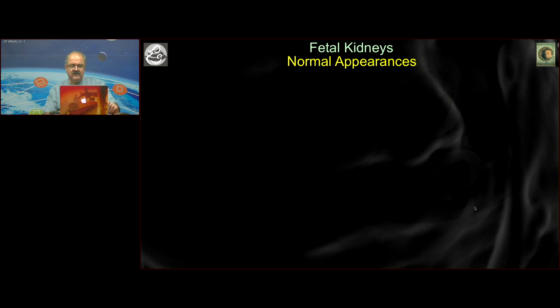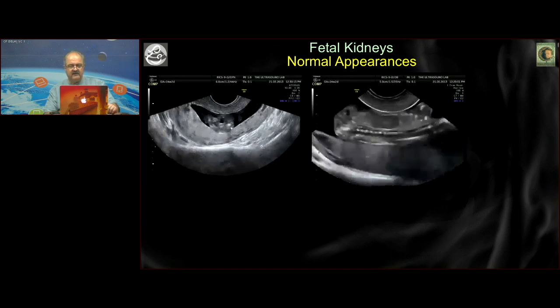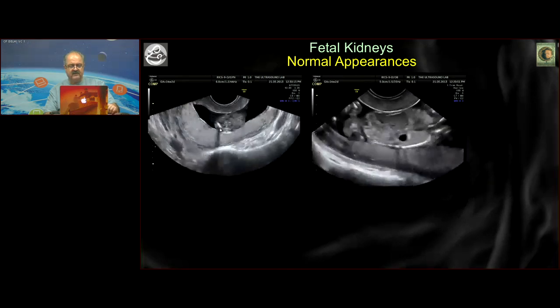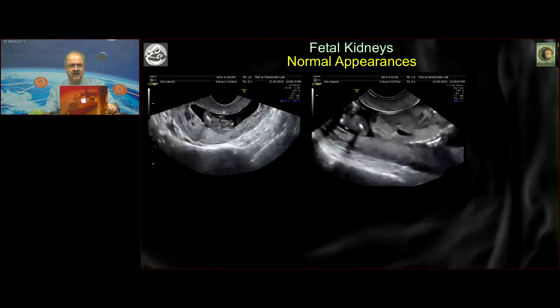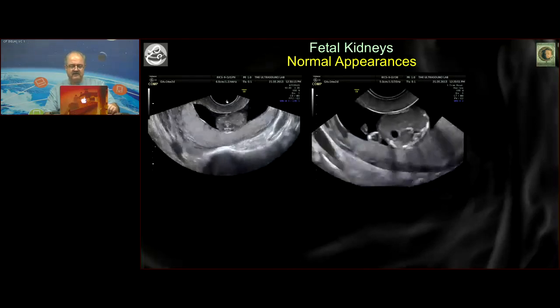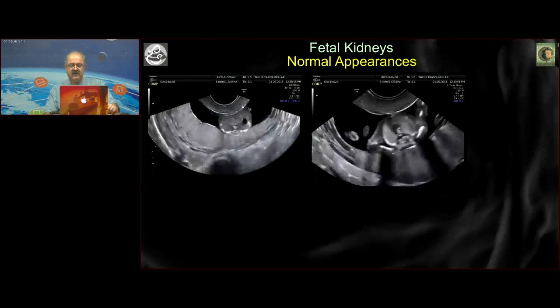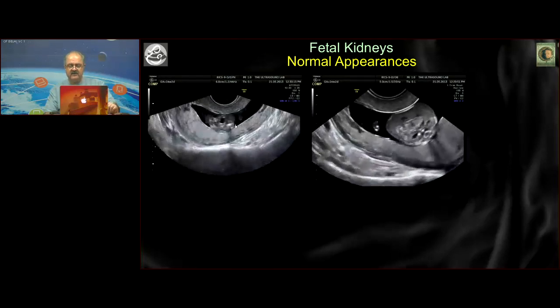The tendency for many of us not to magnify is a little difficult to understand. We often give images like this where we say, oh yes, this is beautiful, I see iliac wings, I see the kidneys here, I see the stomach here, and so on. But it's not wise to do things like this. We must make sure that the area of interest occupies most of our screen, and that way you should be able to see it much better.